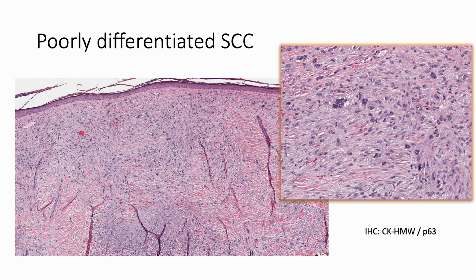So we can use immunohistochemical studies to help us out, including the most, I think, sensitive immunostains: the high molecular weight cytokeratin, or CK5/6, and another one is P63. Usually when you stain those two, at least you can see a few cells being highlighted. If they are not being highlighted, you just expand your IHC panel, including the pancytokeratin CAM 5.2, which is a low molecular weight cytokeratin, and also add P40, etc.